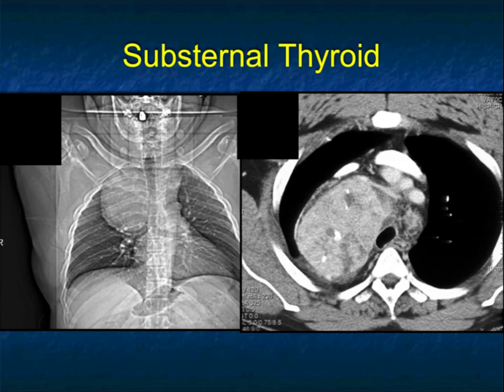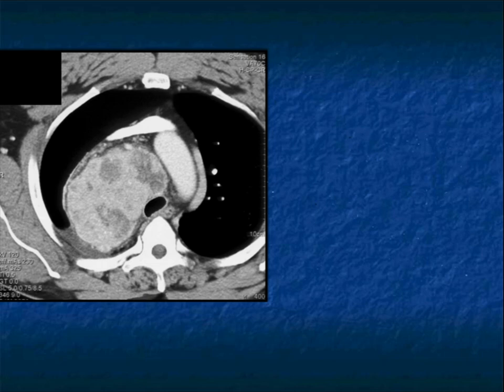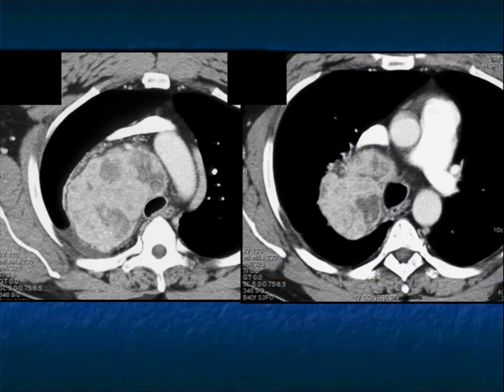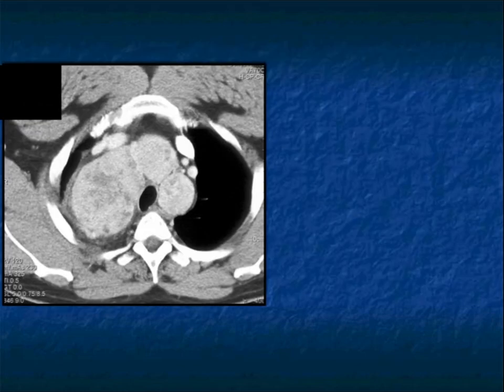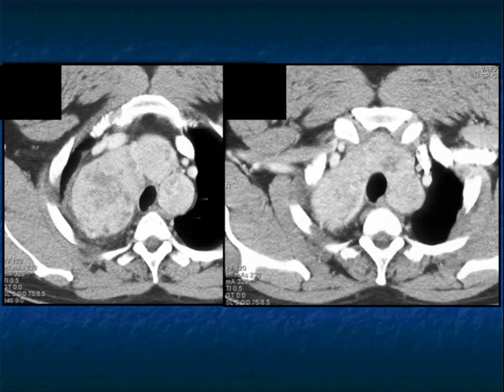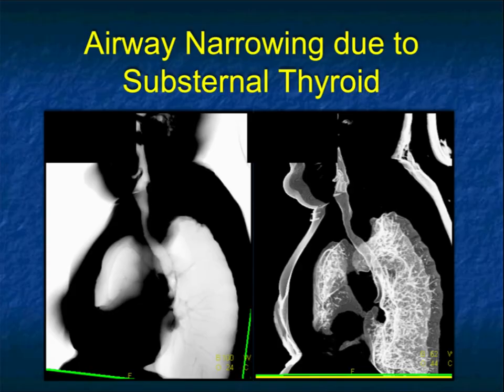Here, unlike the last case which was for the most part surrounding the trachea, this one is more compressing from right to left. Not quite as bad as the prior case, but patients can be symptomatic, and it can be confused with other causes of mediastinal masses, particularly on a chest x-ray. A very nice example of substernal extension of the thyroid going mainly on the right side, causing narrowing of the trachea.